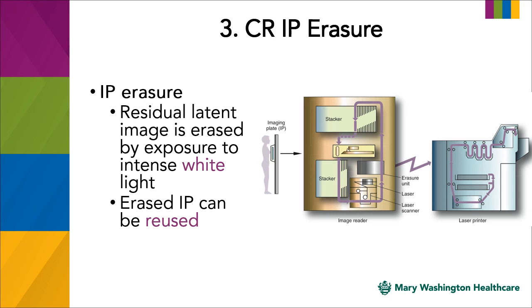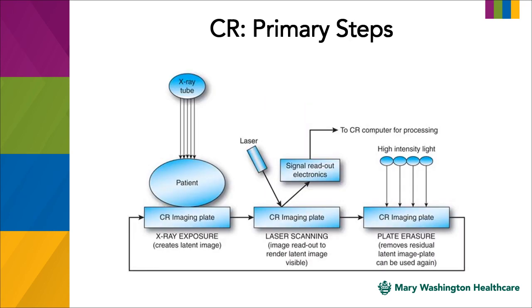And finally, we have imaging plate erasure. The residual latent image is erased by exposure to intense white light, and the erased imaging plate can be reused.